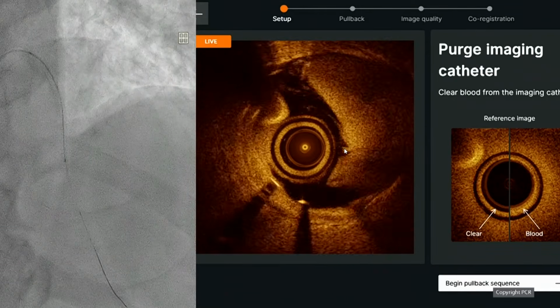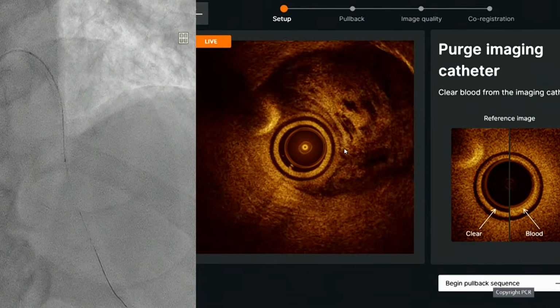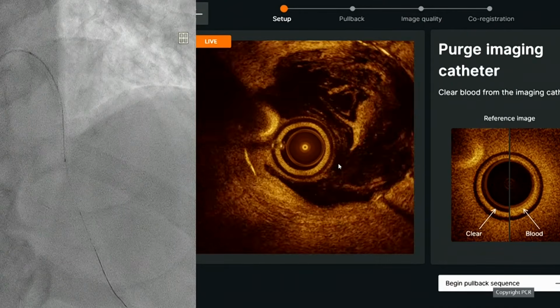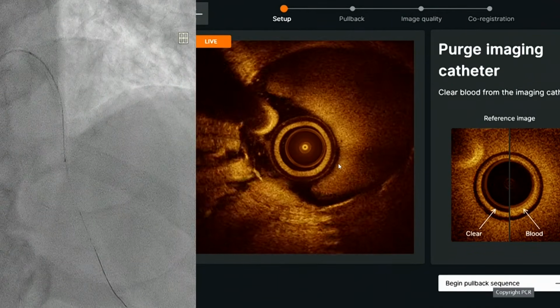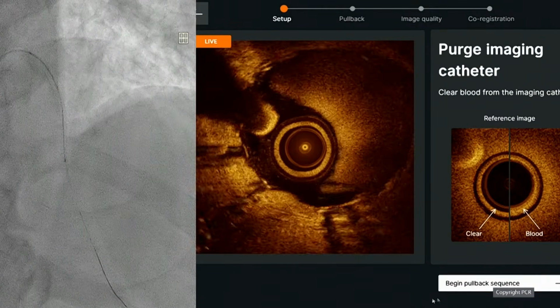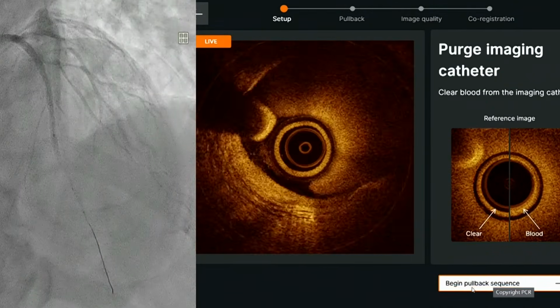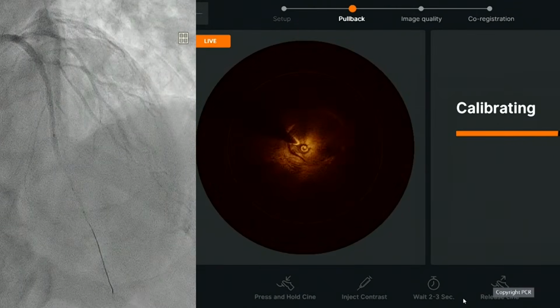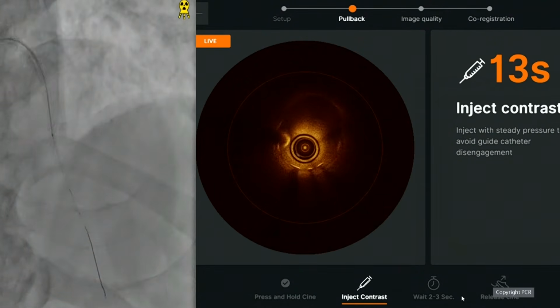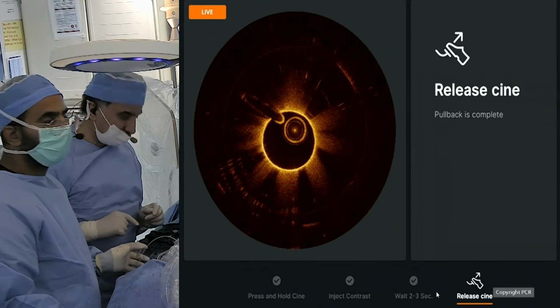I think the problem here is pushing the catheter, because you were talking about the distal disease, and the tip of the catheter cannot cross because there is a disease distally in the distal LAD. And a second problem that we may face is opacifying the vessels, because you're going to block the distal tip of the LAD. So the dye going down is going to be... So I think that was one of my observations. That's why I brought it up. There is no flow because the distal part of the catheter obliterates the LAD, which is quite tight in the distal part, right? But now we get beautiful pictures anyway.